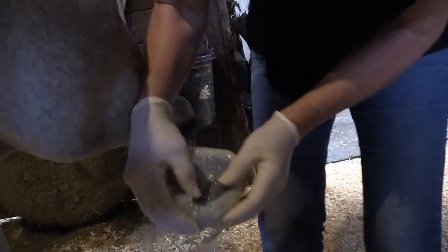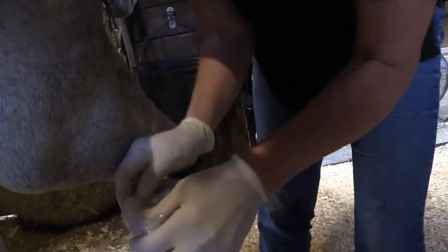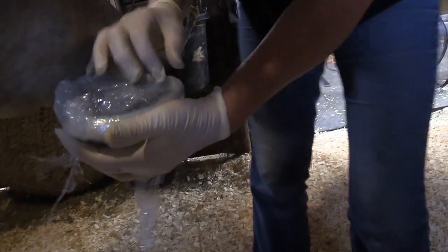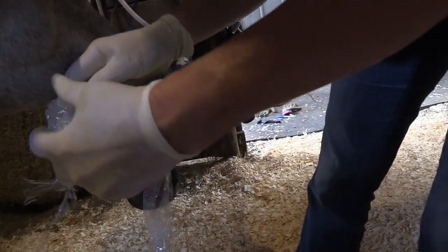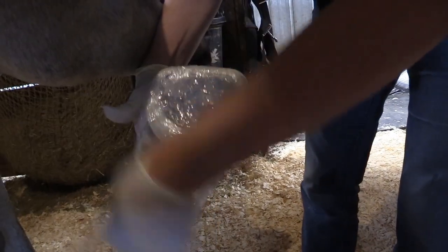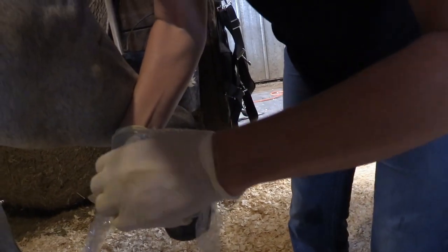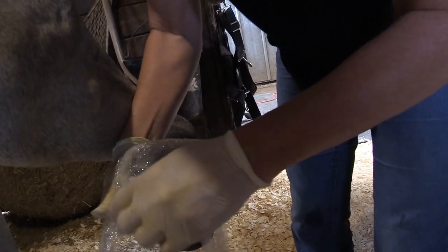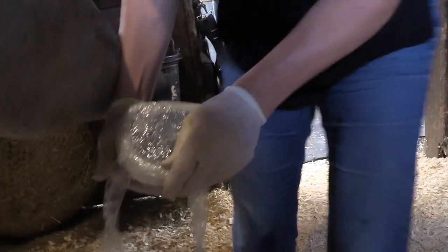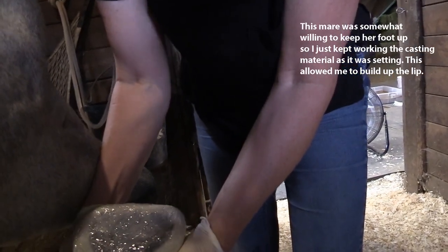I wonder if I'm just gonna not, I'm not gonna put her down actually. She'll hold it. Set already? Nope. I'm just still moving. Just want a big lip there. So you're just kind of building it up? Yeah. I just want it to stay, because as soon as we put her foot down, she's going to put weight on it.